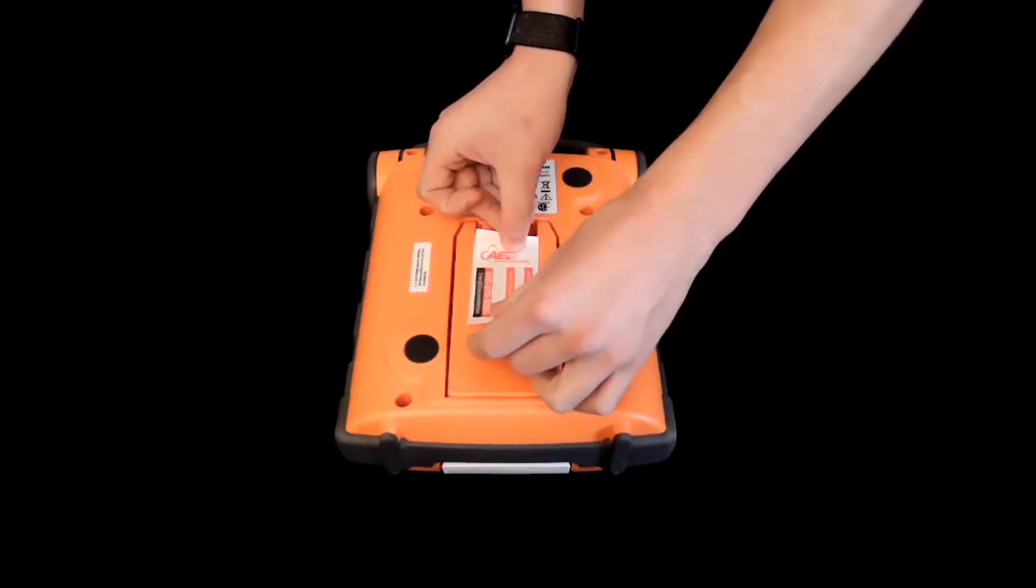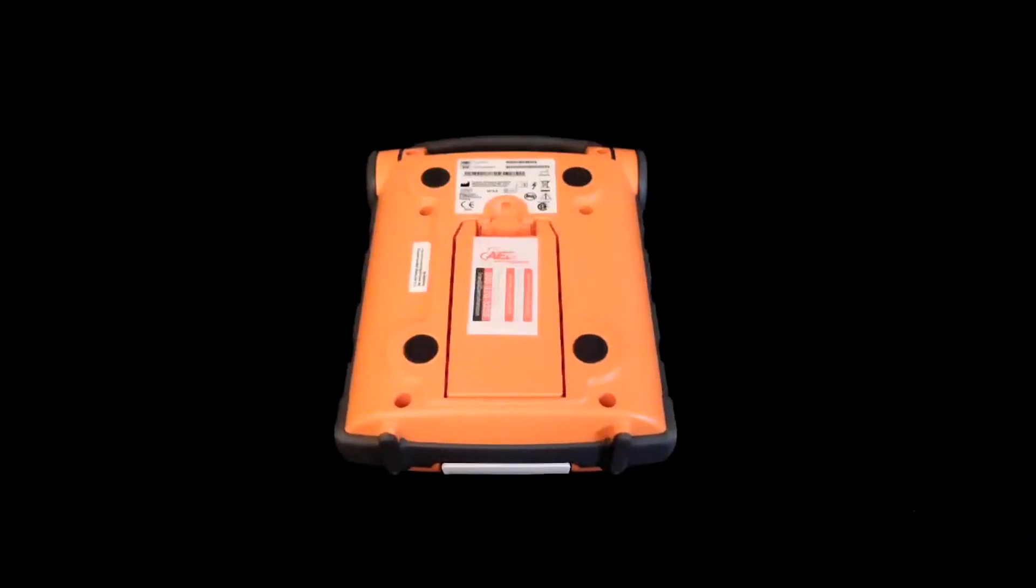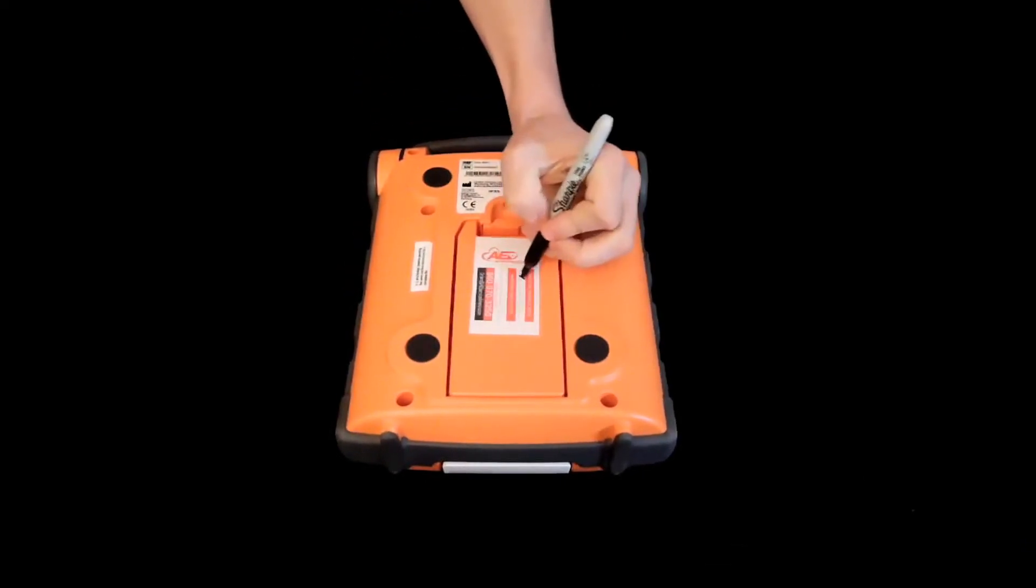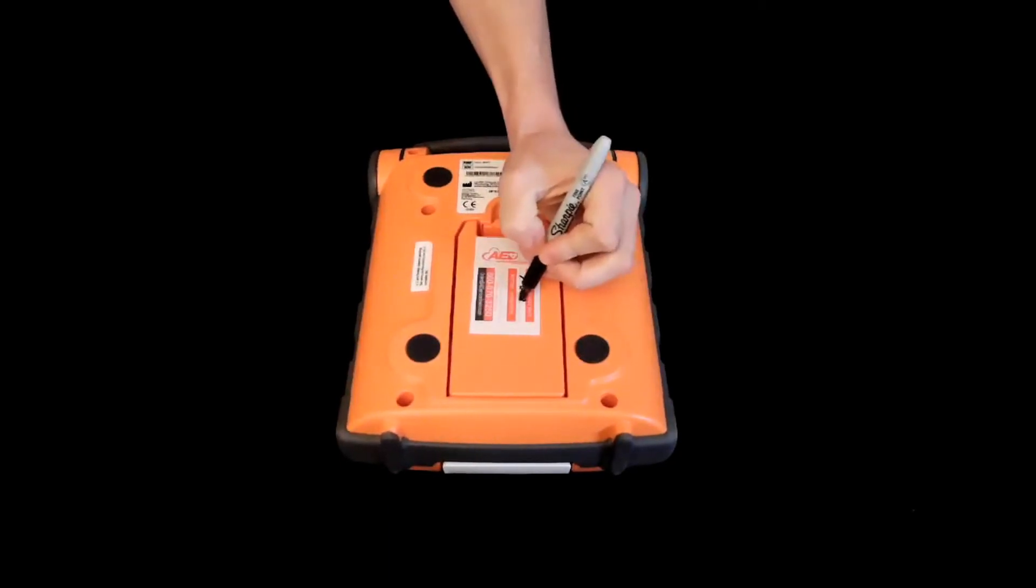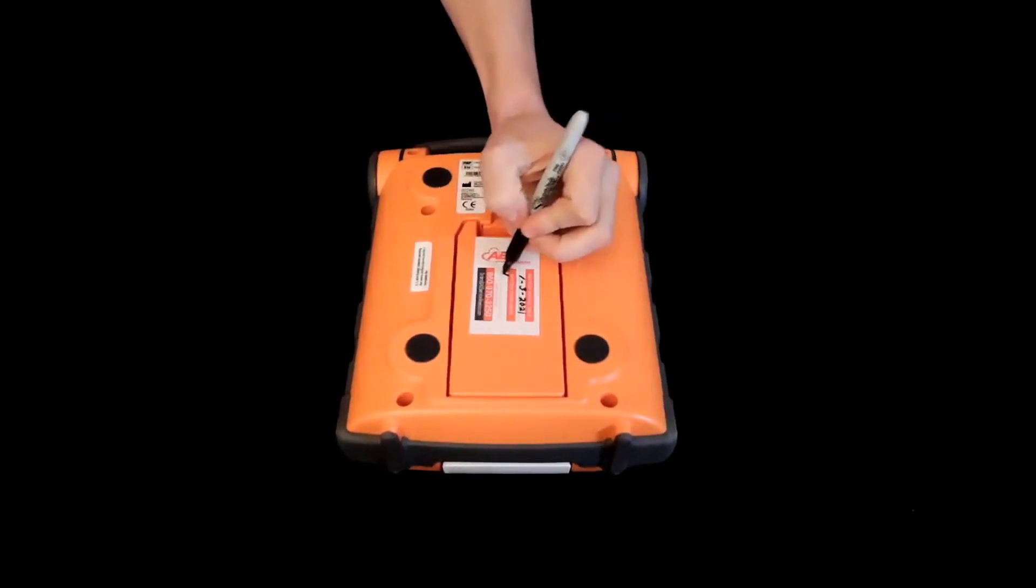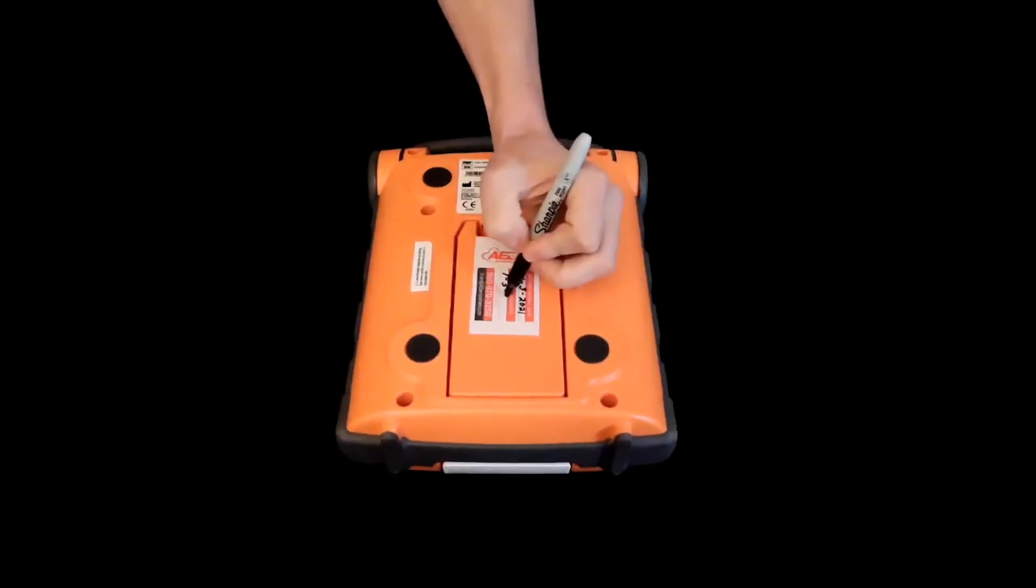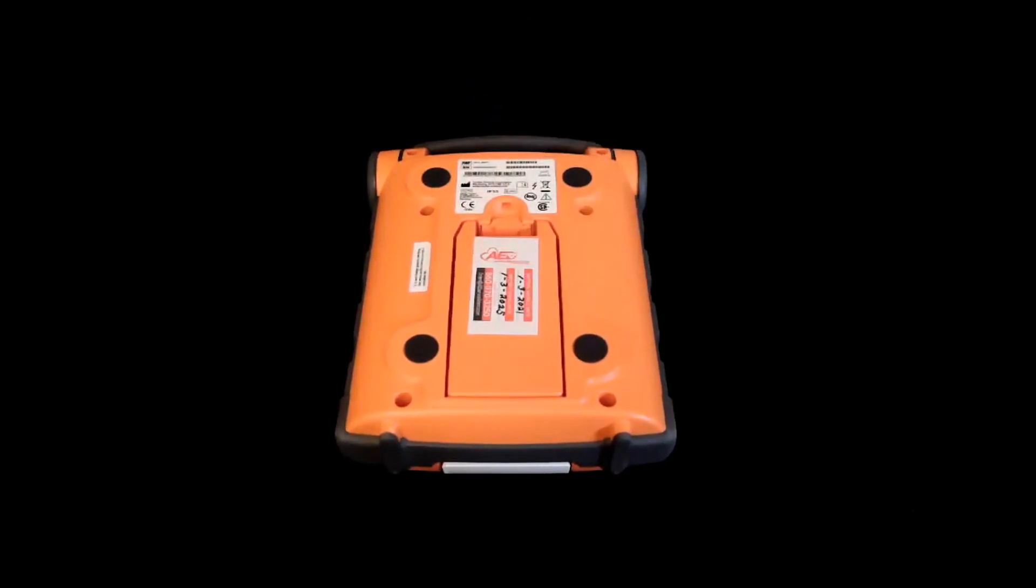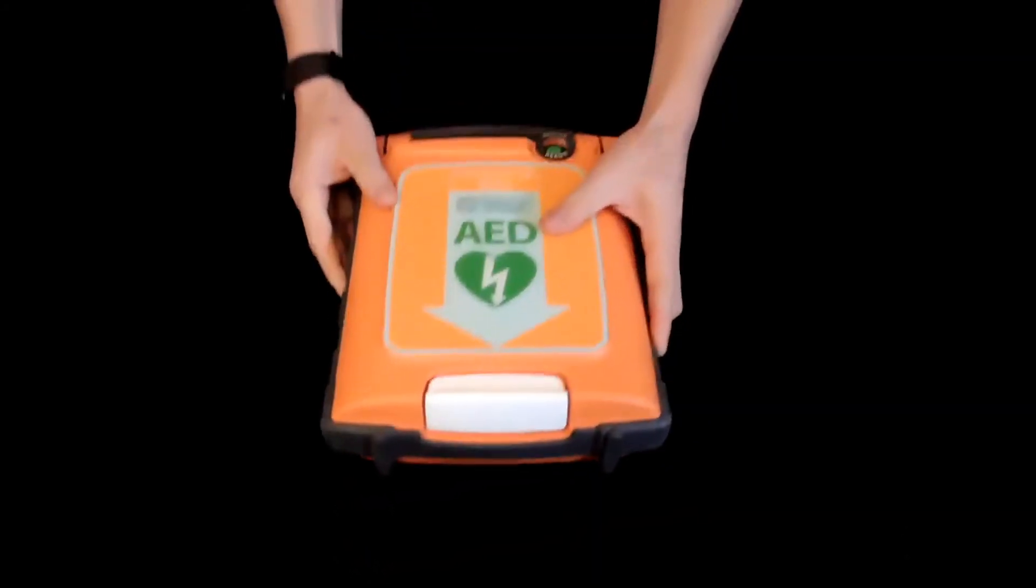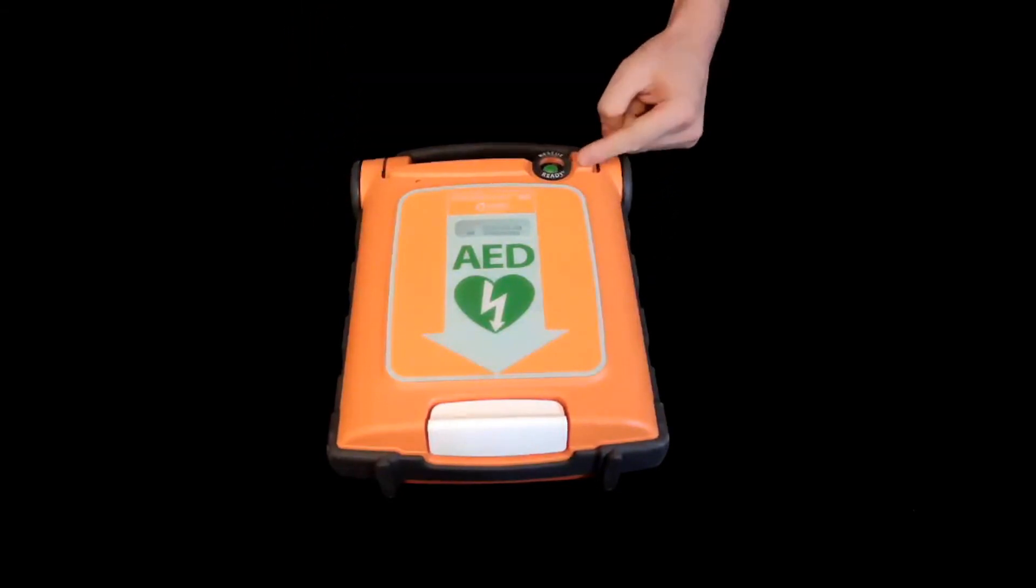Use a sharpie or another method to record directly onto the new battery the date that it was installed into your AED. G5 batteries are good for four years from the date they're installed. A battery installed on January 3rd, 2021 will be set to expire on January 3rd, 2025. Turn your AED back over and verify that the rescue ready indicator is green.